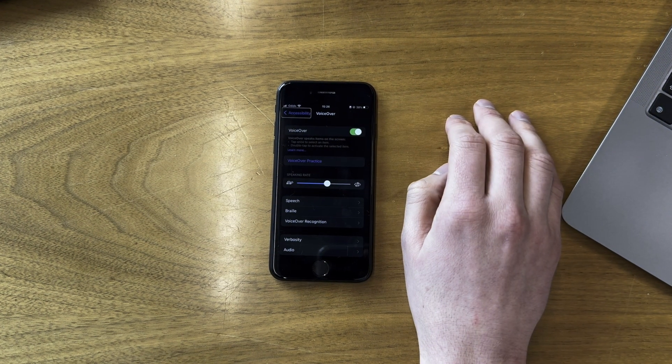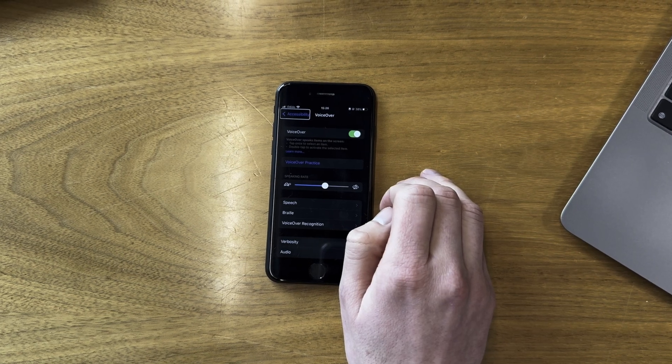Now that your Hable and your phone are paired, the setup is ready to go. You don't need to do anything else. On your phone or tablet, go to the notes app or a place where you can start typing and practice. Also be sure to have VoiceOver on if you're on iPhone, and TalkBack on if you're on Android. That's really the whole setup.